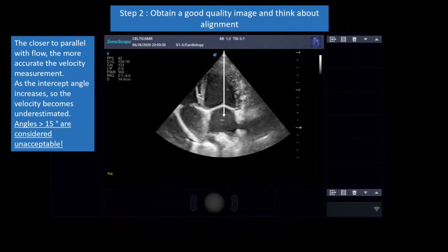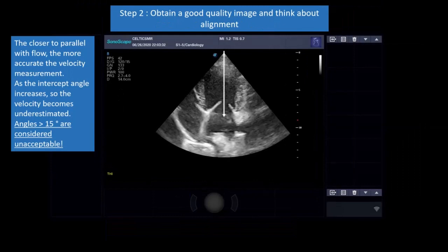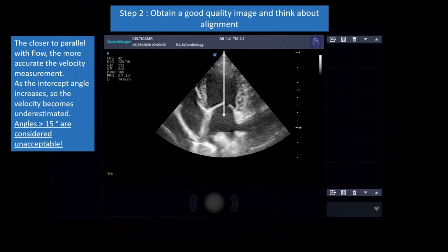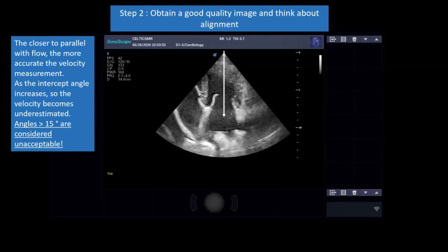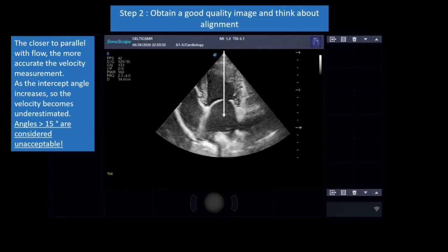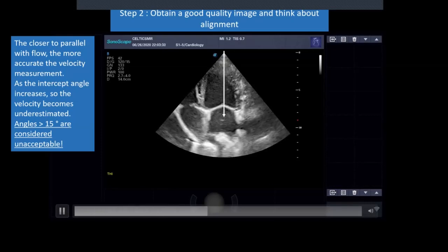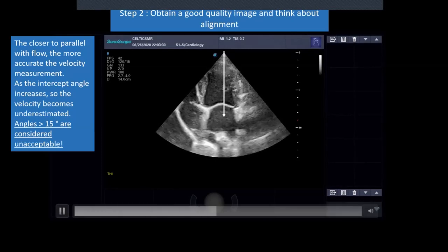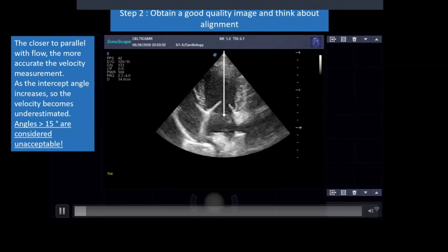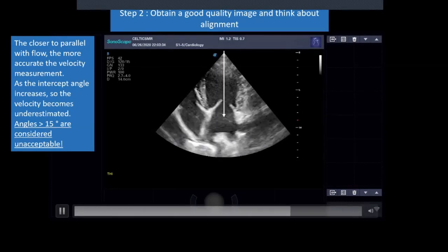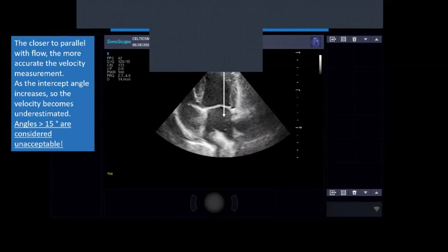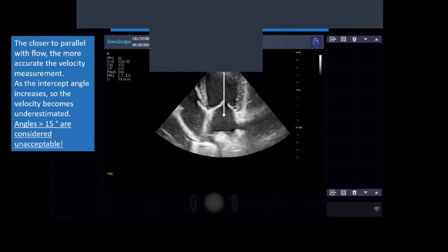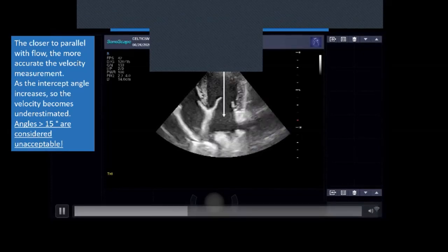Make sure you've got a good quality black and white image before you start — you can't expect a colour flow image to be any good otherwise. Here we have our left apical four chamber view, interested in the mitral valve. I'm staring right down the barrel of the mitral valve, so I could interrogate mitral inflow or mitral regurgitation. I've got really good alignment with flow. If I was interested in the tricuspid valve, I would rock my probe and bring the tricuspid valve to the centre to optimise alignment with flow.